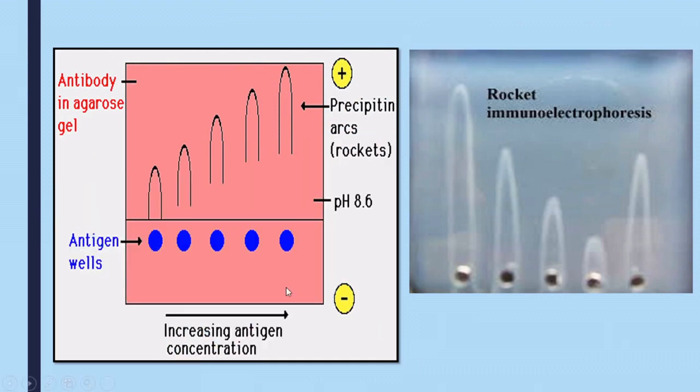So what exactly are we doing? We are having antigen and we are having antibody. But so far, in both the techniques of immunoelectrophoresis and countercurrent immunoelectrophoresis, we had two different wells for antigen and antibody. However, for the first time, we are putting antibody in the agarose gel itself. So while setting up the gel, we have to ensure that we are adding antibody to it. Point number 2: when we get antigen, which is commercially available, we are not putting any unknown concentration of antigen. We are taking antigen in a known concentration and imparting charge to it. So the second step is to impart charge to the antigen. The third step is to dilute the antigen.